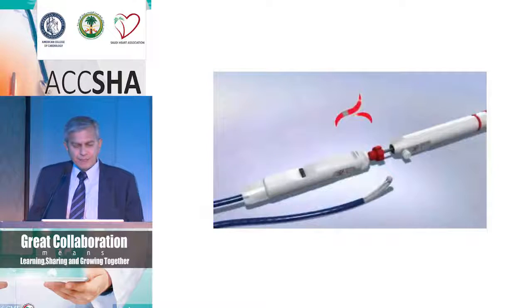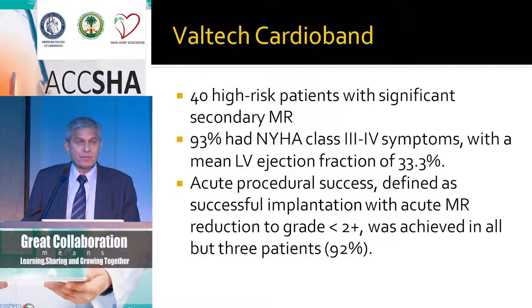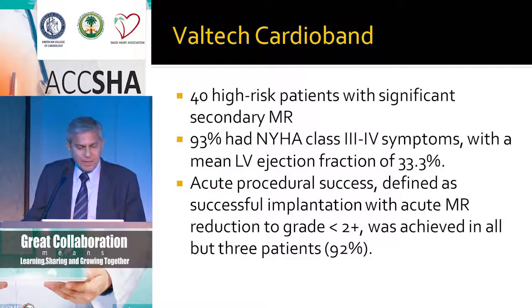So here you see the examples of those anchors by fluoroscopy. There are many of them. They're all screw-like, and they're going to stay there forever, so it's a bit scary when you look at them.